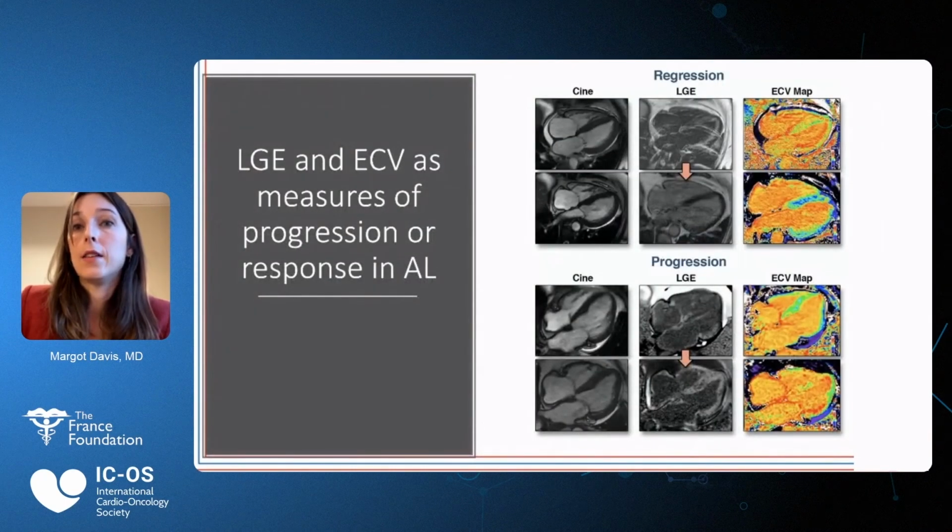We've seen already in Dr. Fontana's presentation the utility of LGE and extracellular volume as measures of progression or response in AL. And again, as you can see here, in patients who progress, you can really nicely see that on these images, and similarly the patients who are responding.